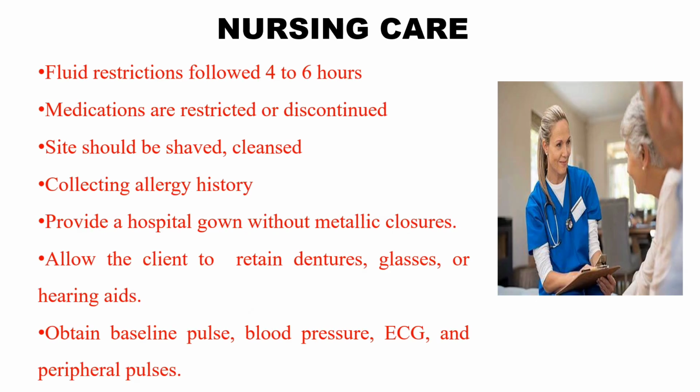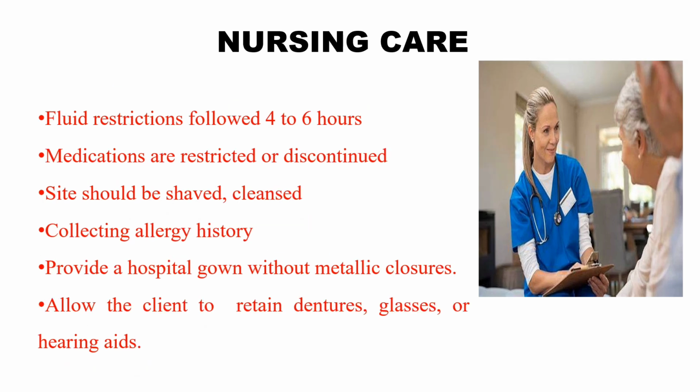Fluid restrictions followed for 4 to 6 hours. Here, ensure that dietary and fluid restrictions have been followed at least 4 to 6 hours before the study. And after that, medications are restricted or discontinued. Ensure that routine medications are restricted, or allowed with permission from the physician, and that anticoagulant medicines have been discontinued. The site should be shaved and cleansed. Anesthetize with local anesthetic agents, and explain the sensation experienced as the catheter is inserted and advanced. After that, collect the allergy history.